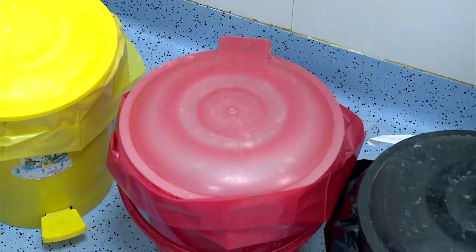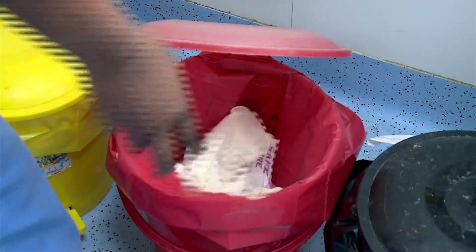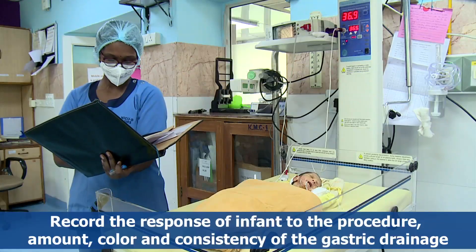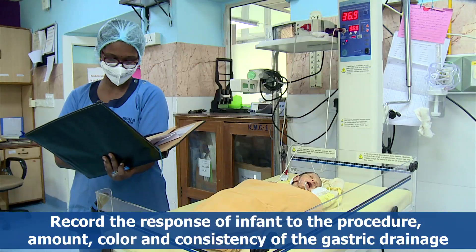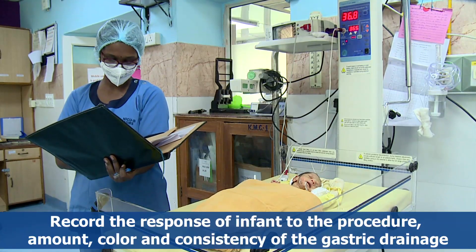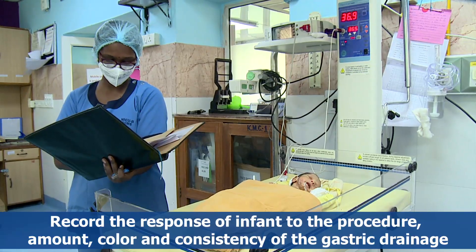Discard the clinical waste generated as per the biomedical waste guidelines. Wash hands and record the response of the infant to the procedure, including the amount, color, and consistency of the gastric drainage.